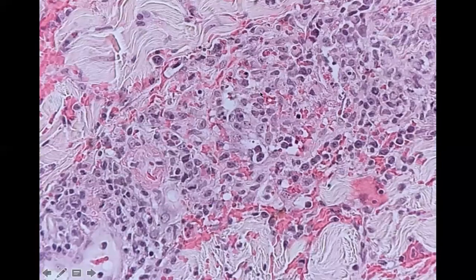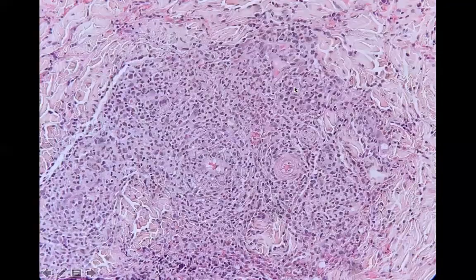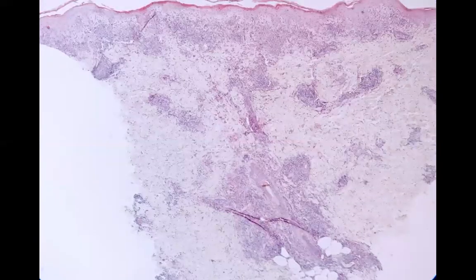And here you can see the fibrin around the vessels, and it's kind of a blurry picture, but you might have some neutrophils and lymphocytes. I'm sure you probably have some plasma cells too. But these kinds of non-specific little necrotic papules, as you know from being on consults or something, if you see necrotic papules, you do have to think about infection. And you may or may not be able to find organism. A lot of time you'll need to diagnose them serologically.